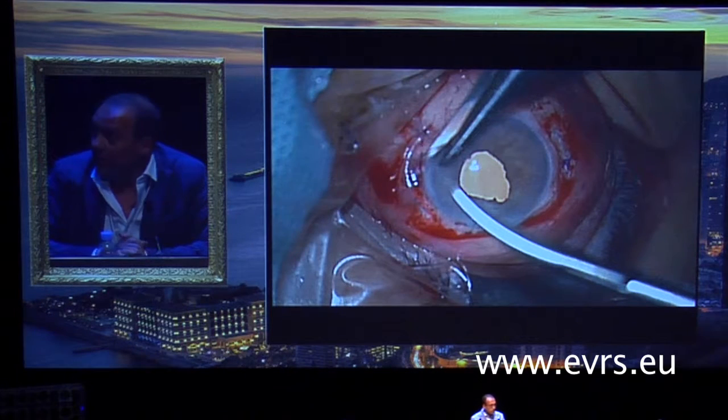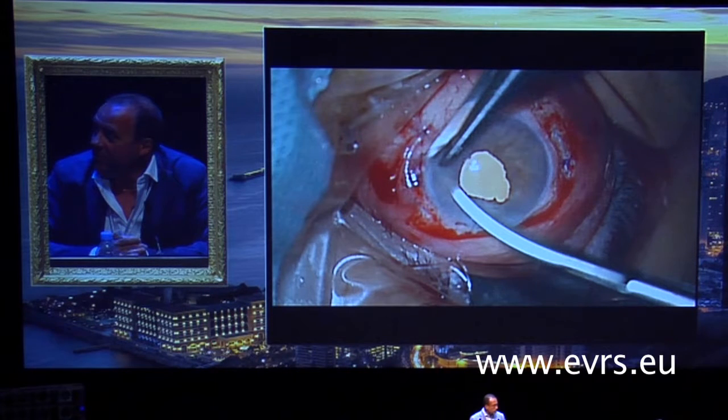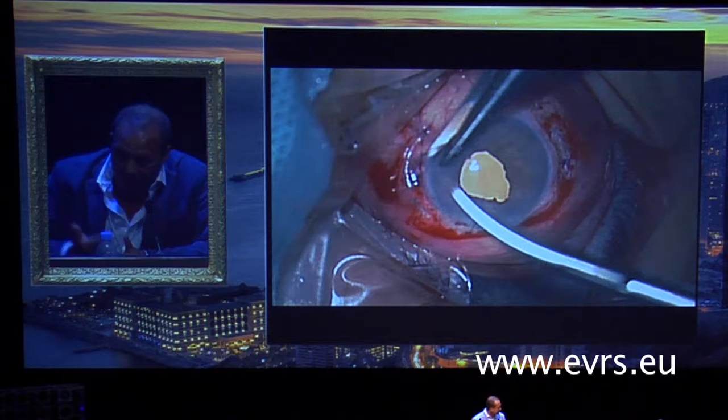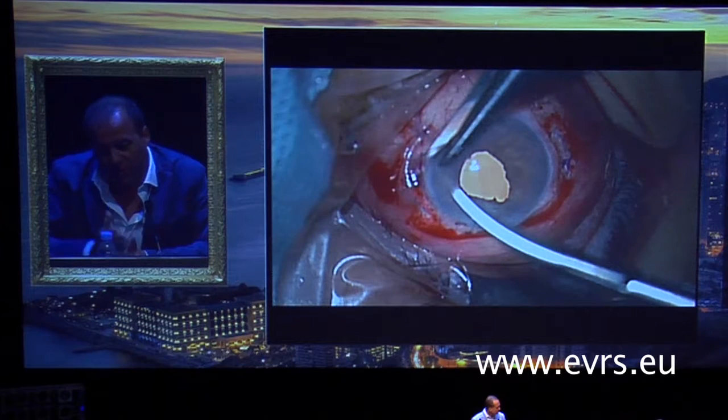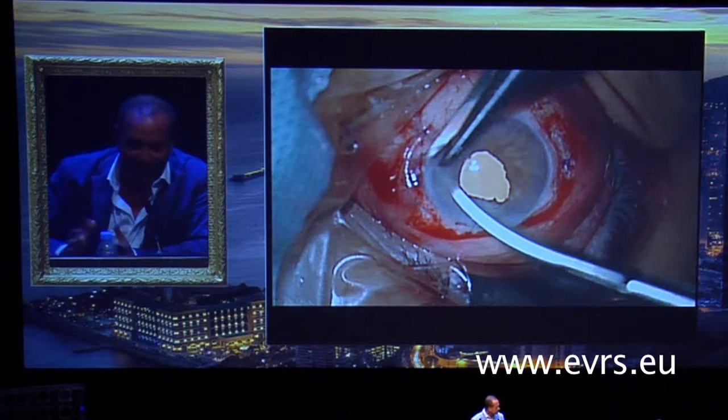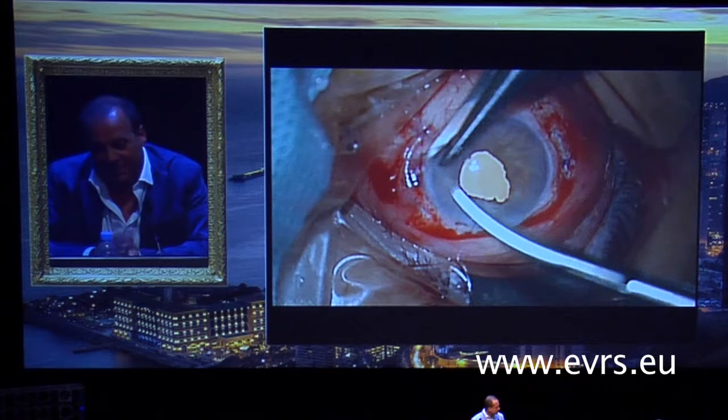Well, you know, there are so many techniques of fixing the intraocular lens, and retina surgeons are more interested in that. Initially, the ARC group described a sutureless tunnel so that they can put it, but there is definitely a learning curve, and especially with smaller gauge and very fine haptics, it's so easy to lose it, to break it, to bend it. So in this way, you don't do that. Probably you have different problems. I have to discover them, but it's quite easy.